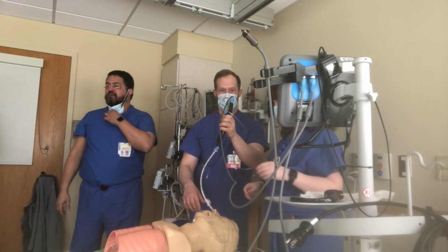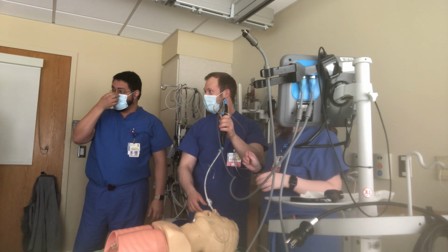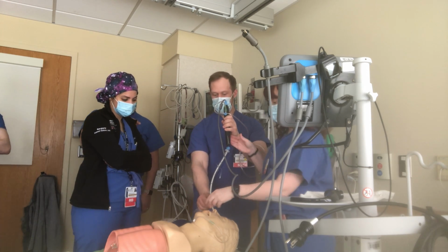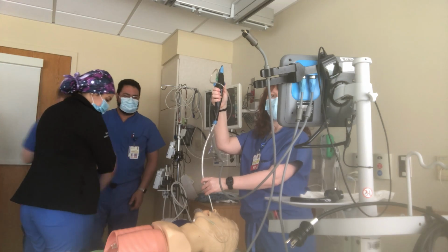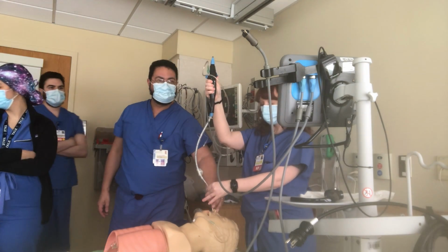What am I doing? Do you want to do it? No. But it's really interesting. Why not? Do you want me to take it out? Don't take it all the way out. I don't know. Good job, first time, on the spot. All right, here, let's go.